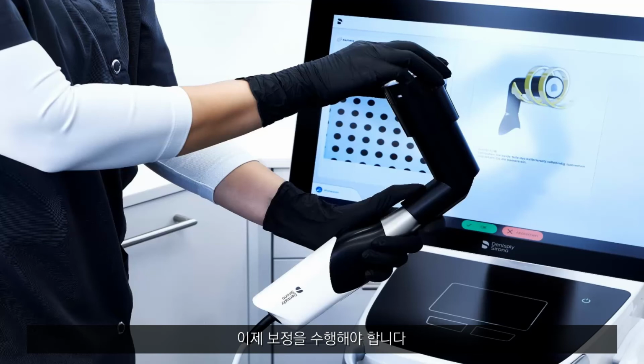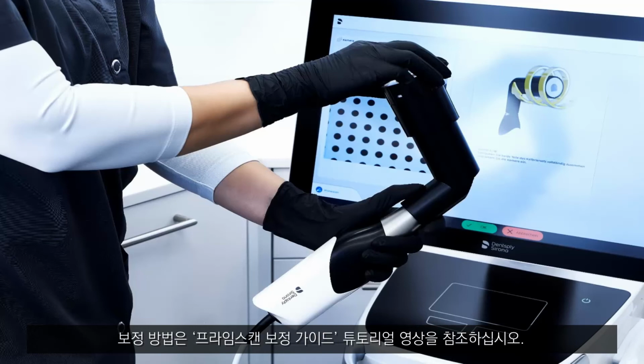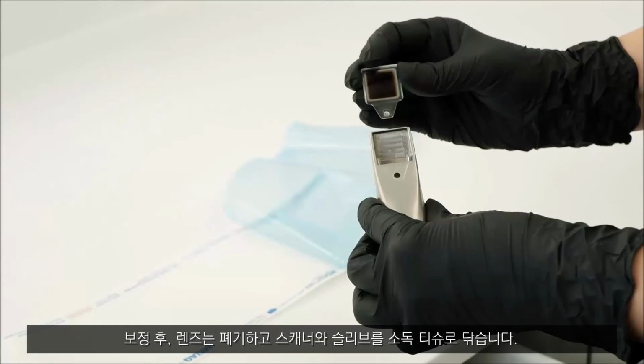We now have to perform a calibration. As we mentioned earlier, the disposable windows come in packages of 50. The calibration process must be performed once for each package. For detailed information about this process, please refer to our video tutorial entitled Calibration Processes with Primescan. After calibration, both the scanner and the sleeve must now be wipe disinfected. Insert a new disposable window before starting the scan procedure inside a patient's mouth.